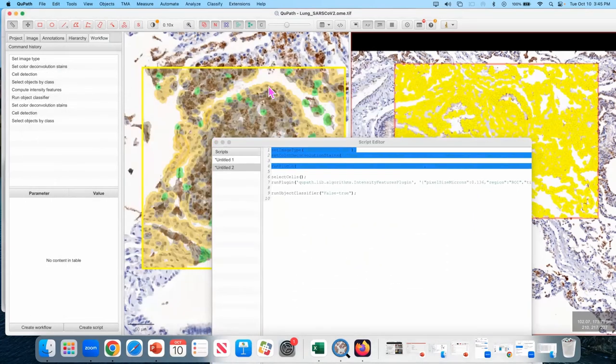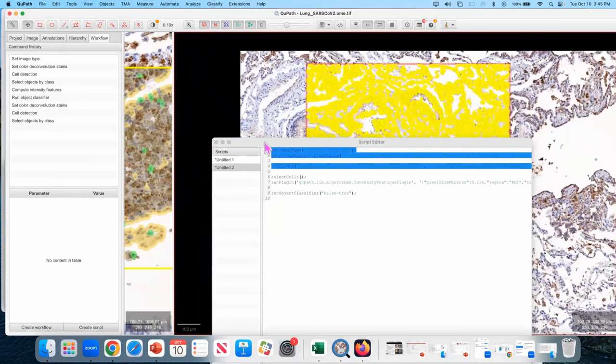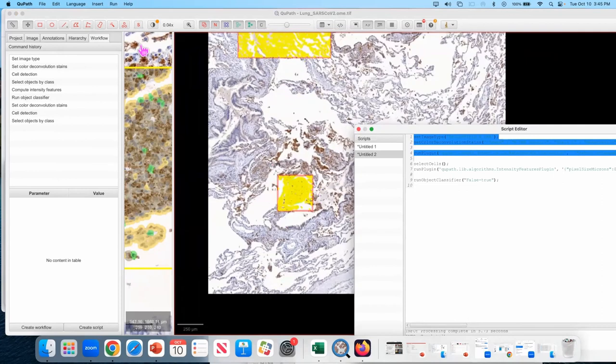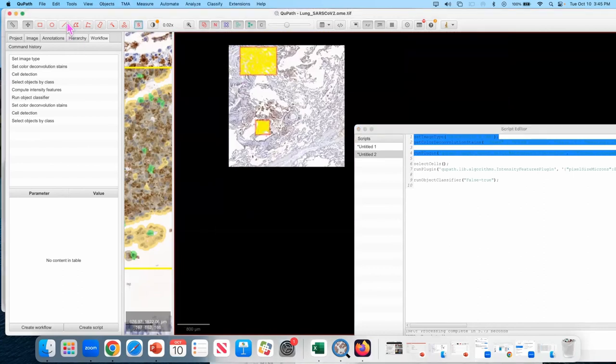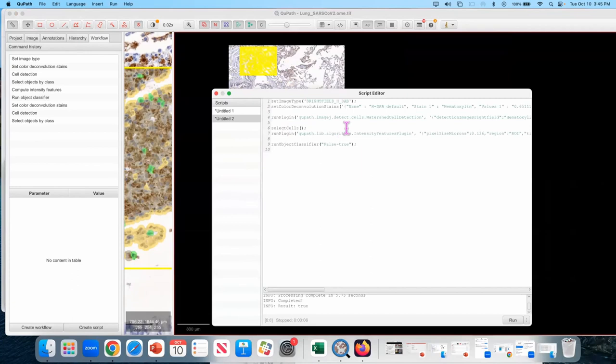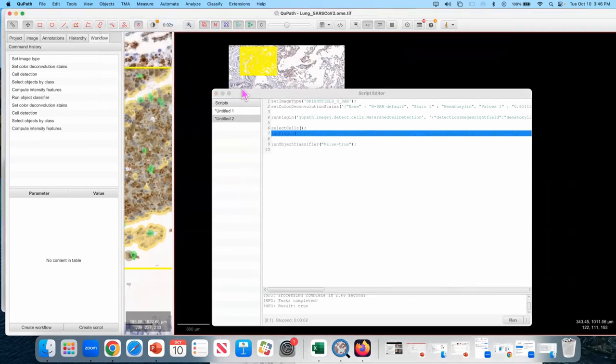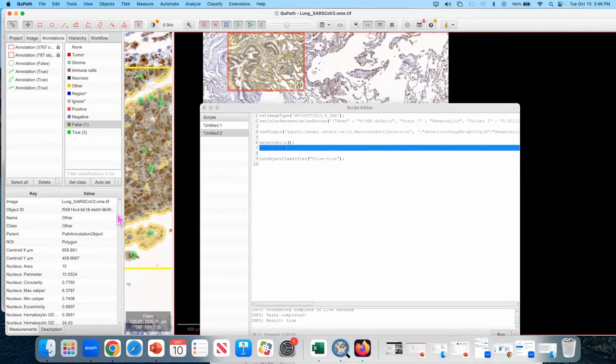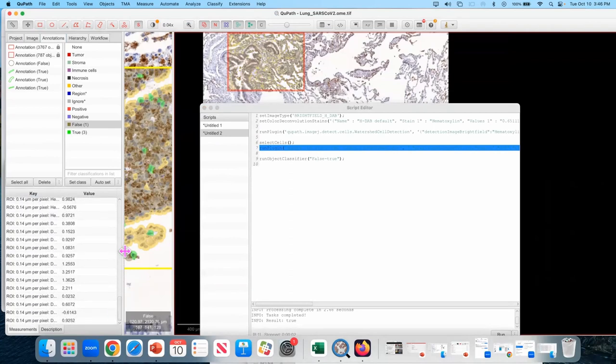In reality, I selected all of the cells in that image, including the ones at the bottom. So just to not add unnecessary measurements to them, what I'm actually probably going to do is take the selection tool and just select that cell. And then I'm going to run this part of the code, which will do the Haralick features. See if I applied them to, yep, got them. And then I can run the classifier.